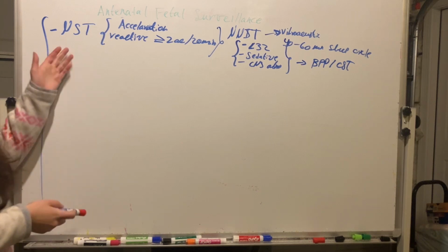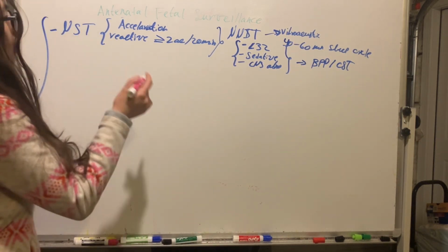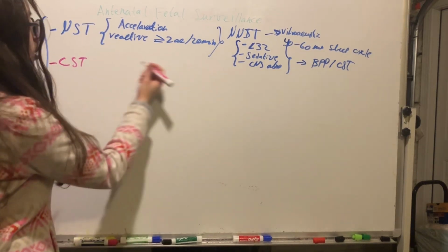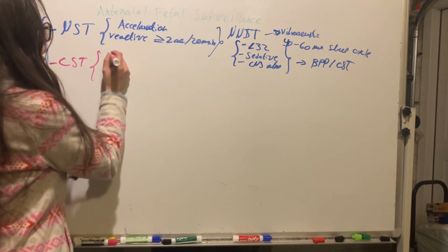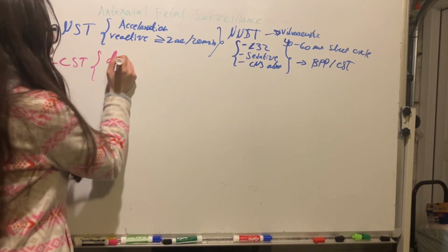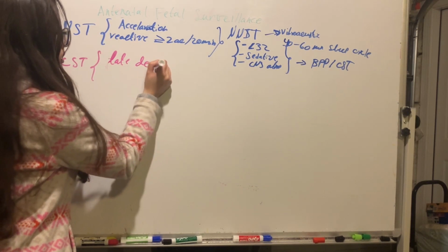So another way to do the antenatal fetal surveillance is with the contraction stress test. Here what we are evaluating is the presence of late decelerations.